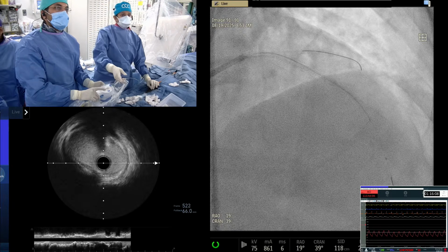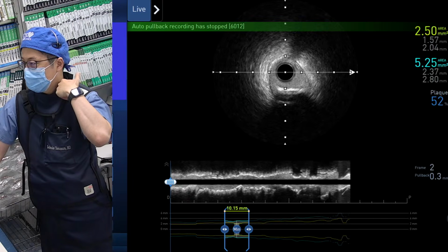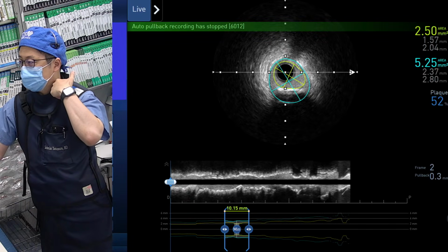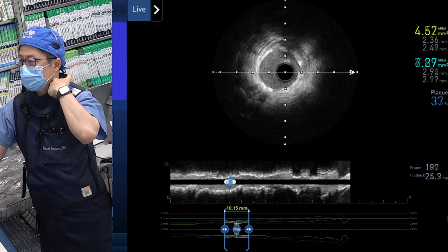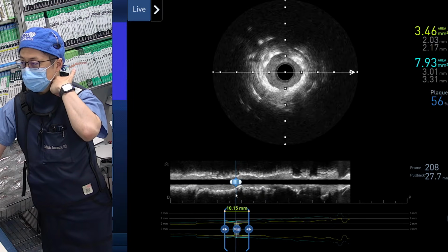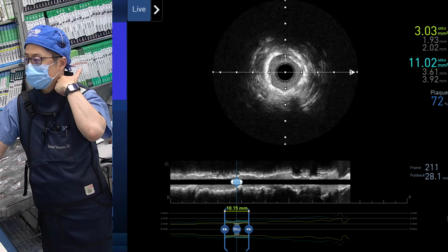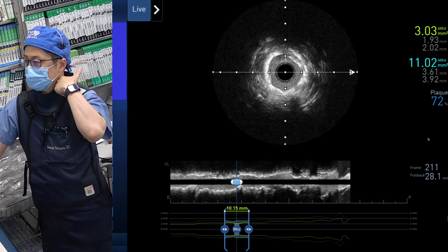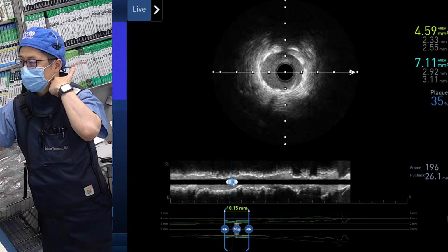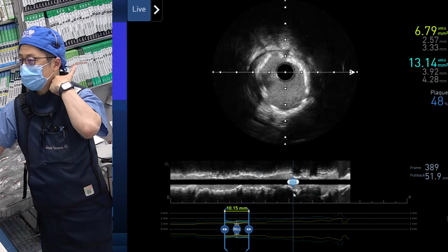Nice, on the block. Yeah, left main. Okay, again, nice, around 6 point something. Okay, good. Yeah, it looks good. The distal part is kind of under-expanded focally. We didn't see this calcium before, but the distal part of the stent has an area of 3 point something. Okay, and coming to the proximal, yep, the proximal lumen area is like 6, 7.